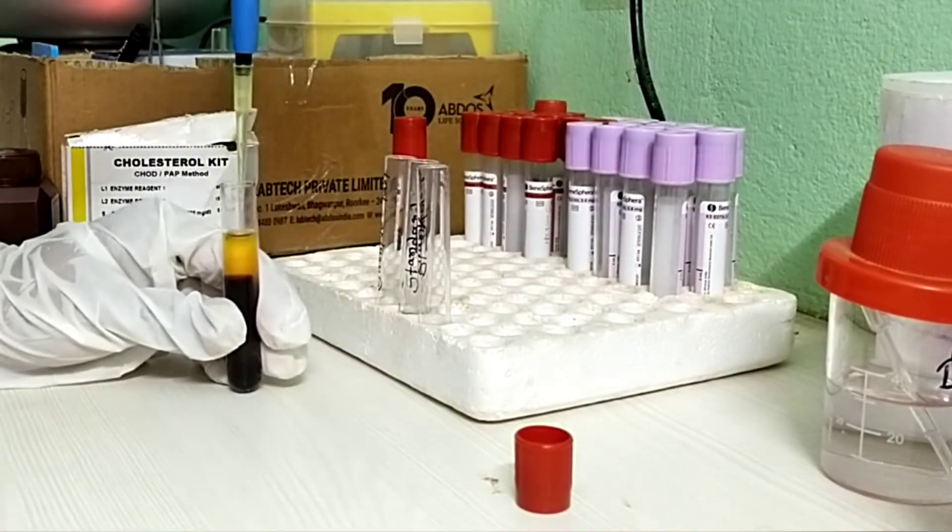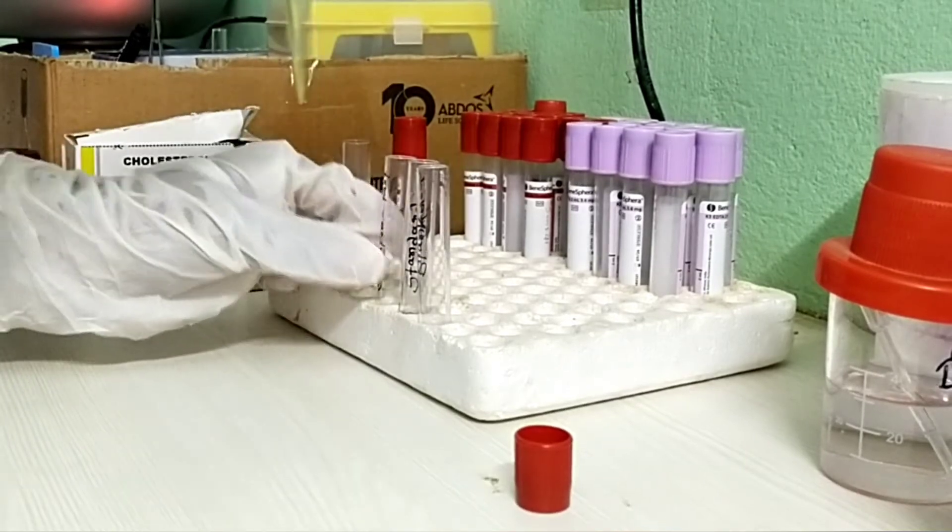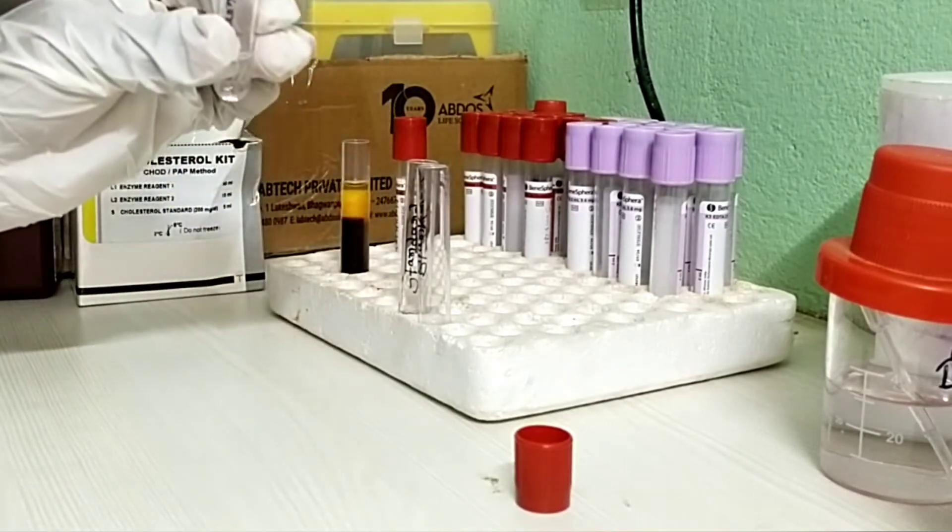Now take 10 micro liters of blood serum sample in the sample marked test tube and mix well with working reagent.